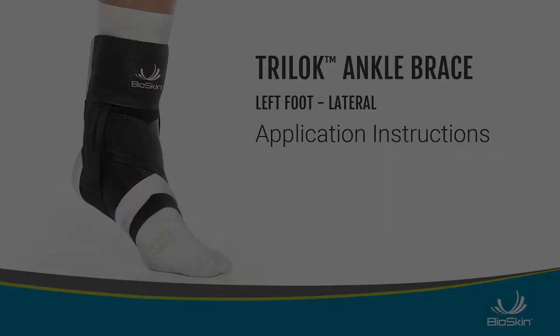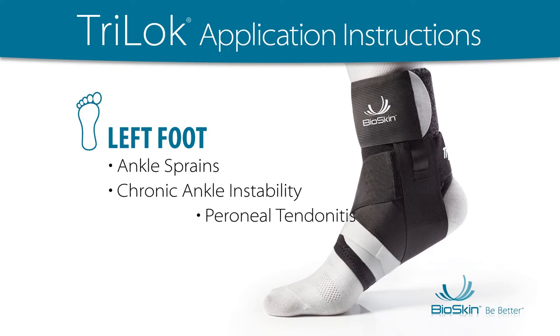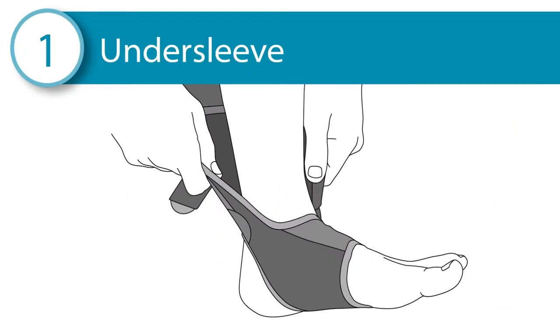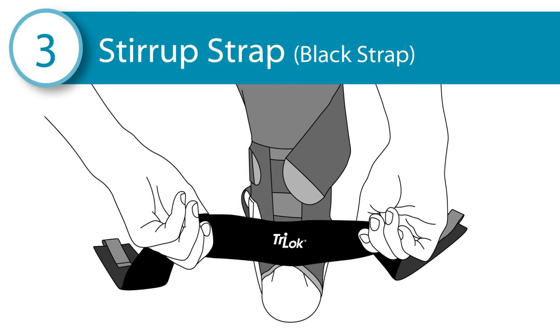Tri-Lock Application Instructions. Left foot application for ankle sprains, chronic ankle instability, or peroneal tendonitis. The Tri-Lock has three parts: the undersleeve, the white footlock strap, and the black stirrup strap.